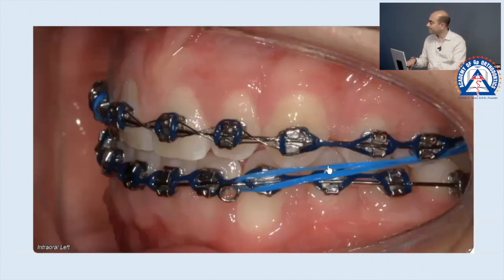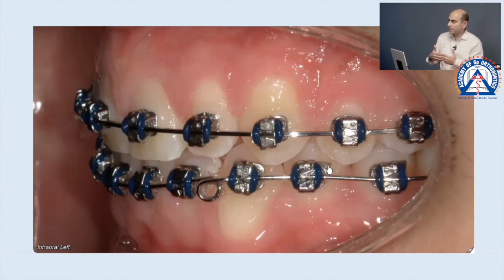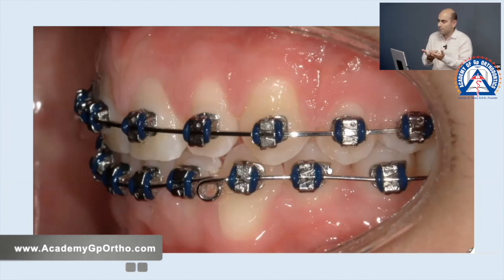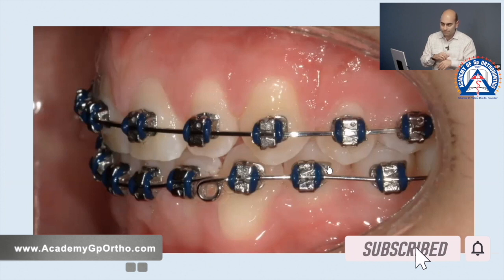Before, after. You see that? So in stage 2, you have to be smart about how you close spaces. Otherwise, you end up with midlines off, posterior space open, and a lot more work in stage 3.